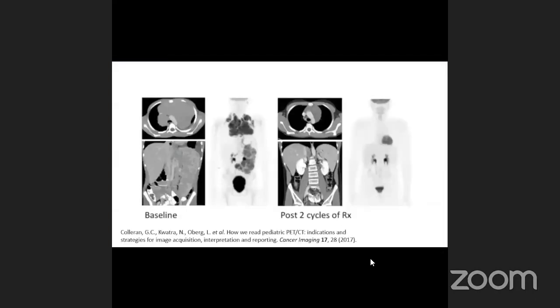Let's see these images. So one of them is the baseline and one of them after treatment. If you give 3 choices, this patient has partial response, complete response, or he is stationary. Which one do you choose? After 2 cycles of, yes, complete response.